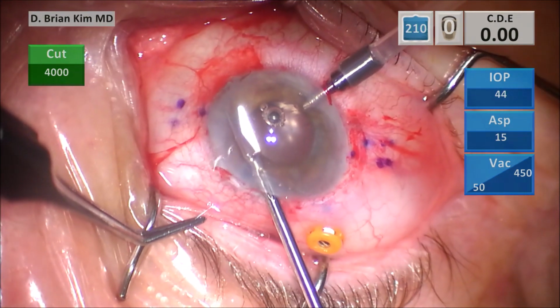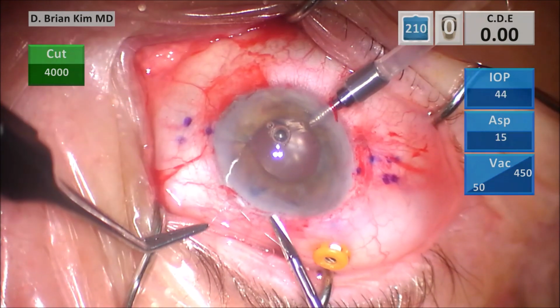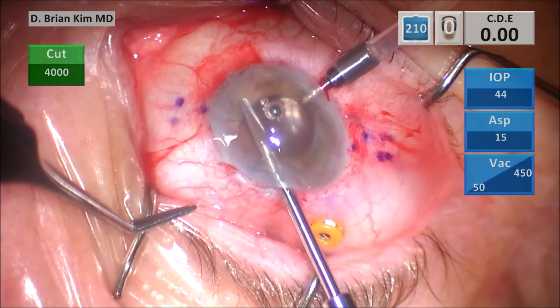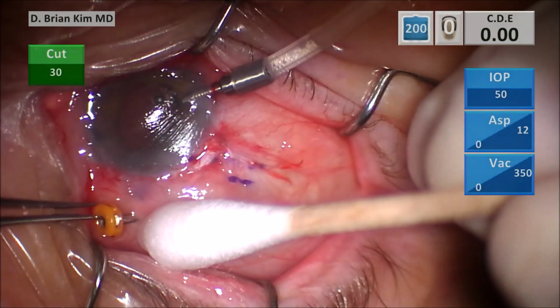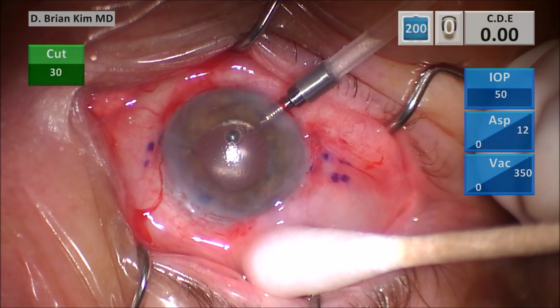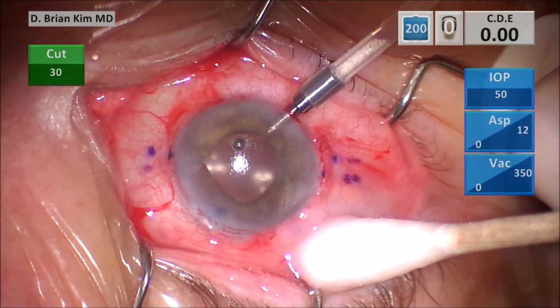And so by doing it this way, you can see that this dilated and distorted pupil was larger than the optic, and so the patient was having quite a bit of double vision, triple vision, quadruple vision. And so by doing that pupilloplasty, the patient did notice that double vision, triple vision, quadruple vision was much better.